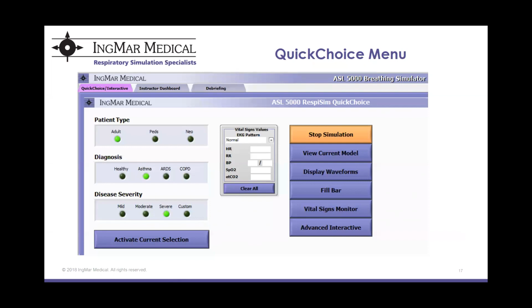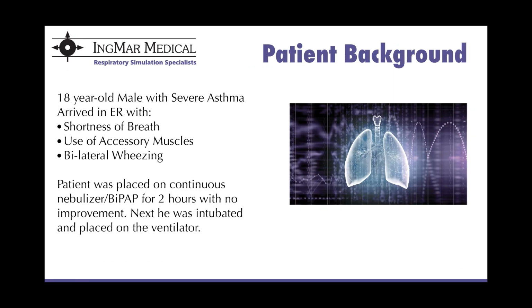So now that we've talked a little bit about how the ASL 5000 works and the way that we're able to create our respiratory conditions, I'd like to move into today's scenario. Before we begin, I'd like to give you some background information on our patient.